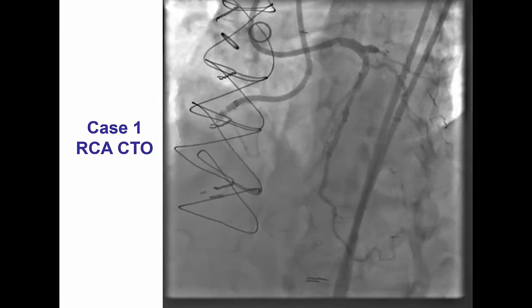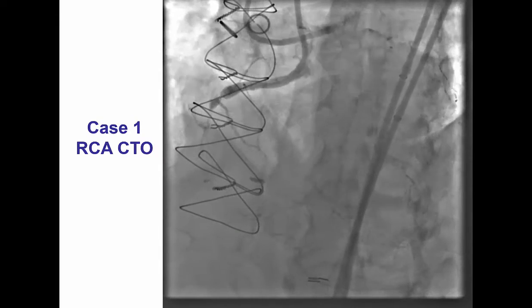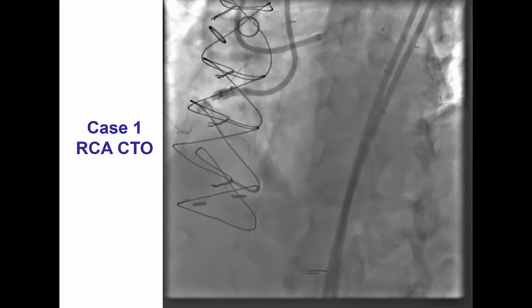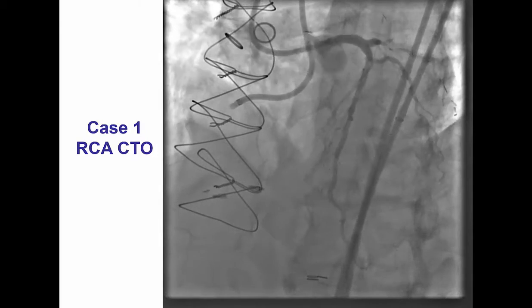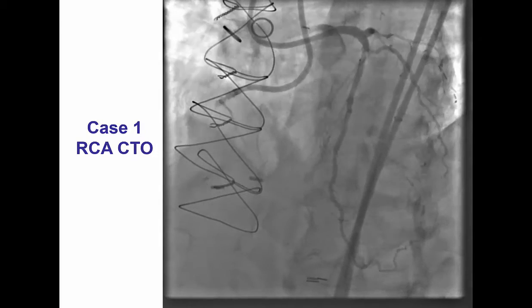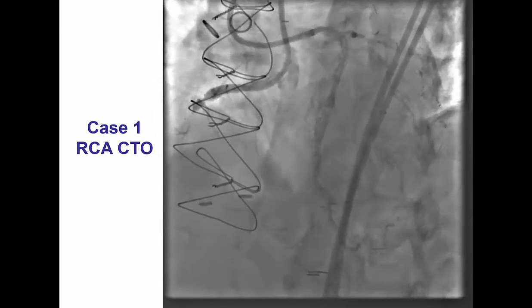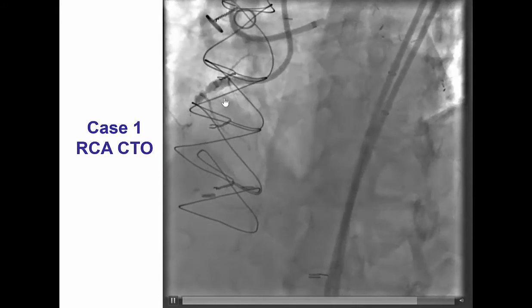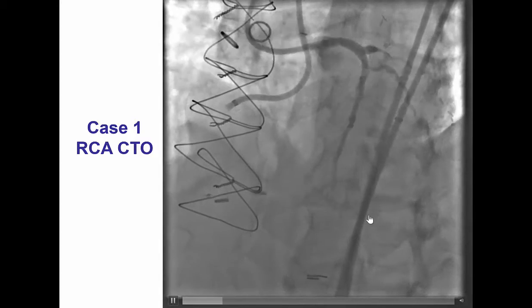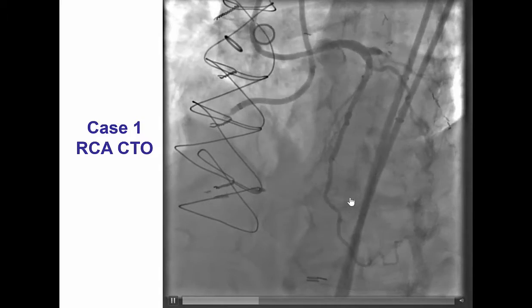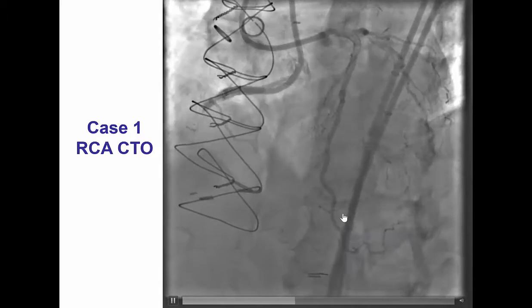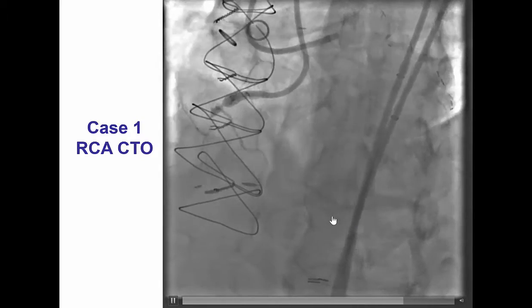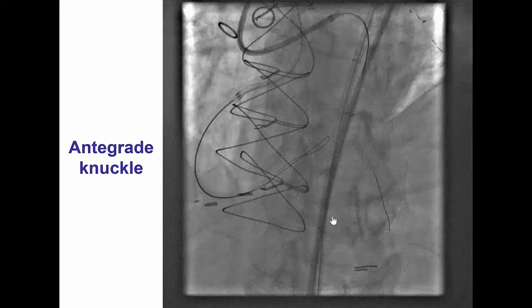The patient had previous coronary bypass and presented with refractory angina. He was referred for PCI of the right coronary artery CTO. The right coronary is occluded in the mid-segment. On dual injection, there is faint filling of the distal right coronary, posterolateral and right posterior descending artery.